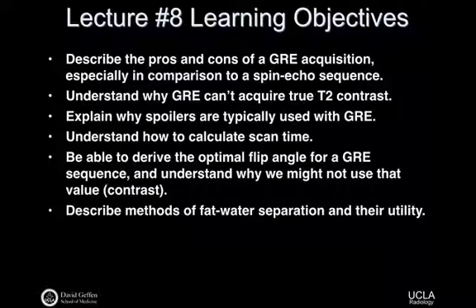After we've acquired an echo, we're sort of done with the magnetization, and spoiling is a way of getting rid of it so that it doesn't somehow enter into a subsequent TR. If we don't control the magnetization, it's still there somewhere. It could leak into the next echo that we want to acquire and contaminate it. And so spoilers are a way of destroying the magnetization.